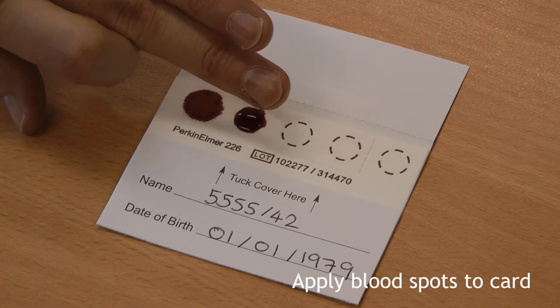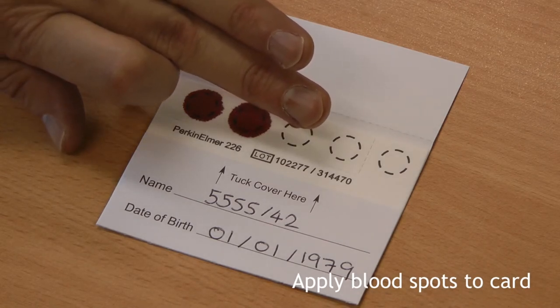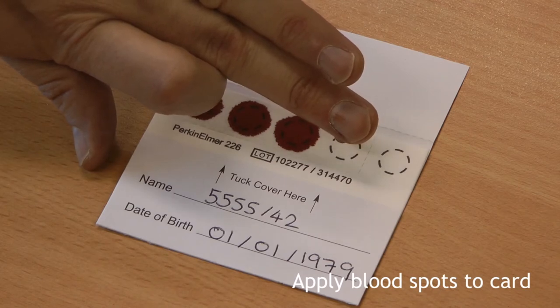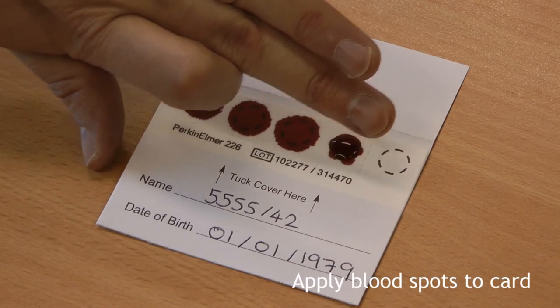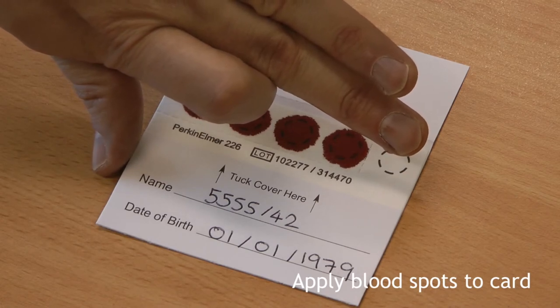Ask the patient to hold the bleeding finger over each circle on the card and, if necessary, press the finger to encourage bleeding. Spot blood onto each of the five circles on the card as shown, making sure enough blood gets onto the card to fill each circle.